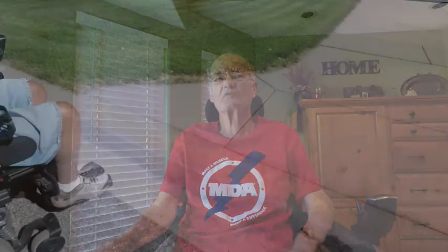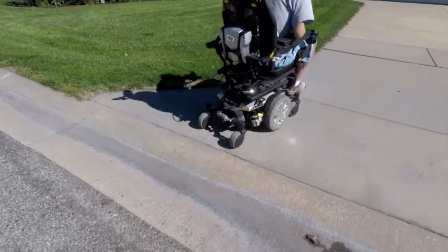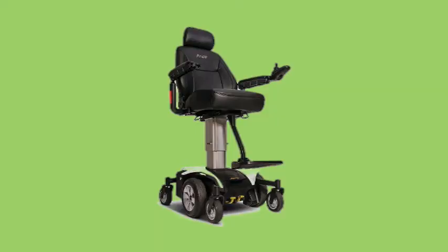Remember, for outdoor use, the larger the drive wheels and the larger the caster wheels chosen, the better it will work for you. If you only intend to use the power chair around the confines of your home, the mid-wheel design will work great for you as long as you have adequate space to operate it in.